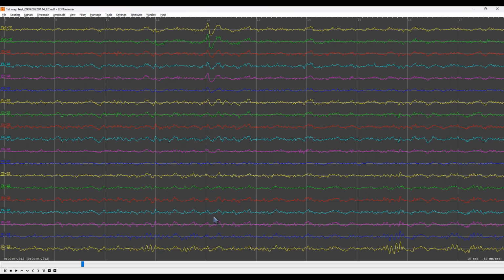So again, like we talked about on Wednesday, if you get somebody with neck problems, whether that's just really tight muscles, or maybe they should be seeing a chiropractor more often. They've got subluxations in the cervical vertebrae that are in turn putting tension on those muscles. Then we would see that showing up down here.